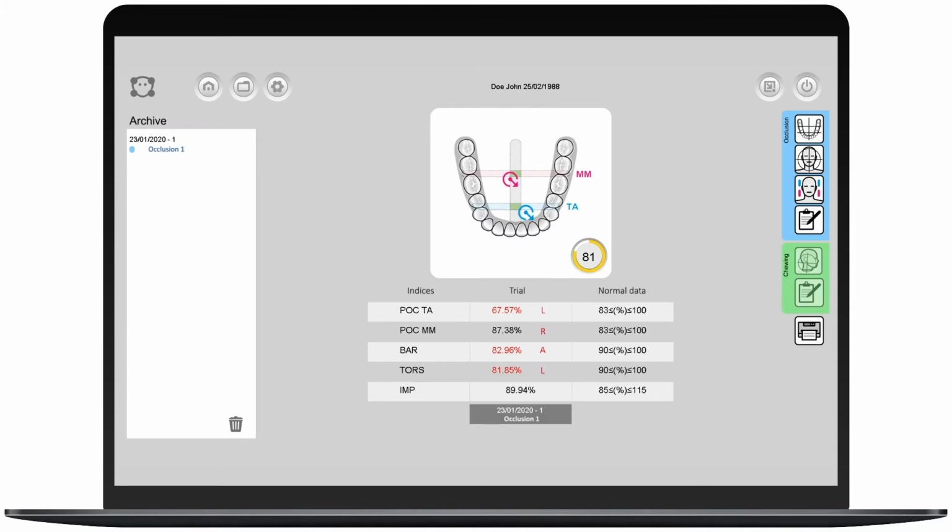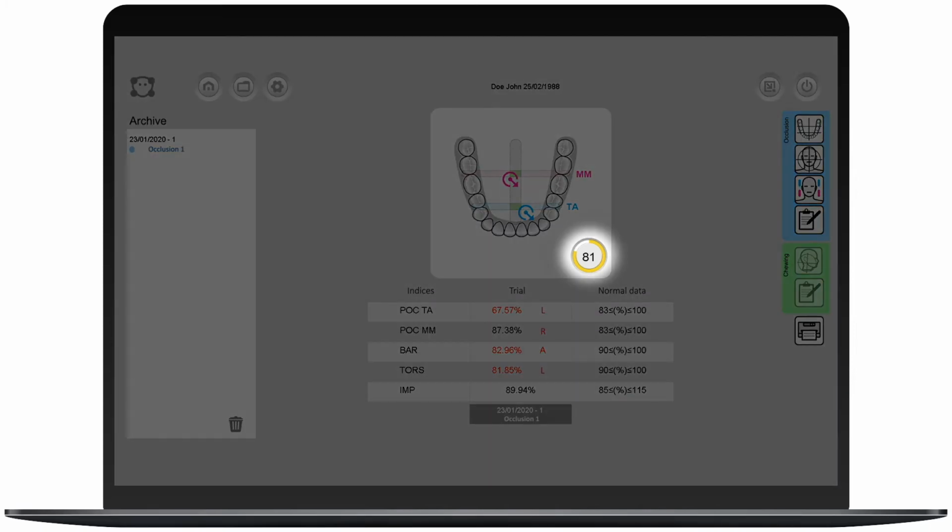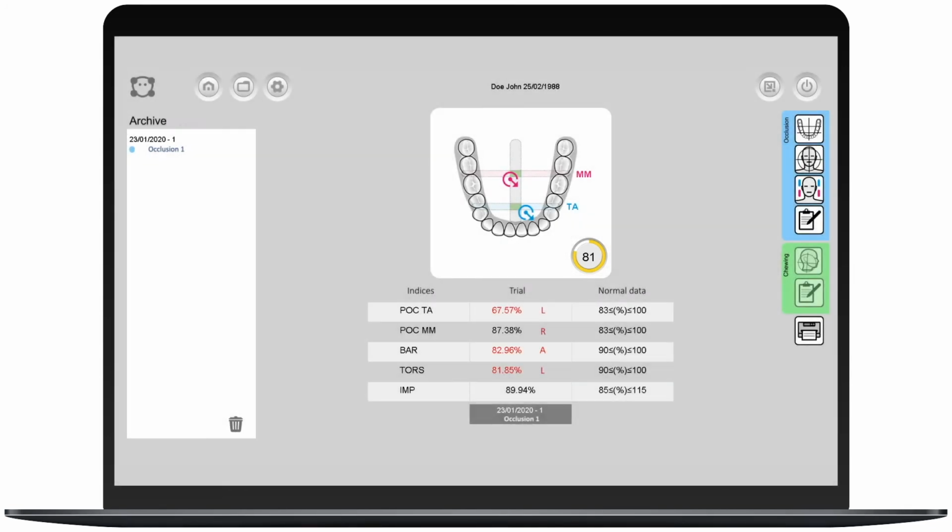Next to the image of the mouth, there is a dial which displays the global value of neuromuscular balance, which is an average of all of the calculated values. In this case, we can see a value of 81%.